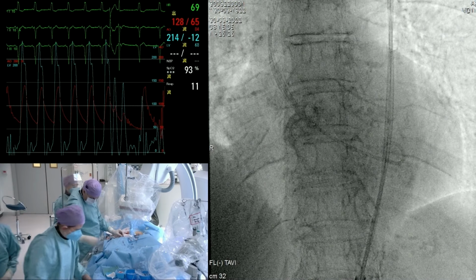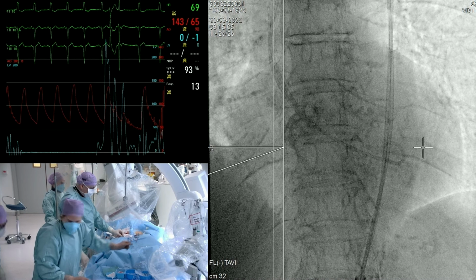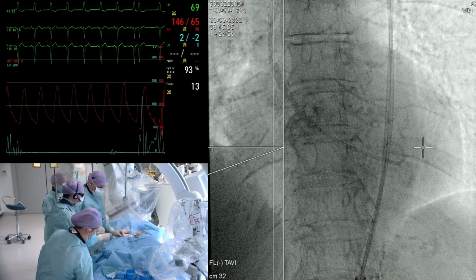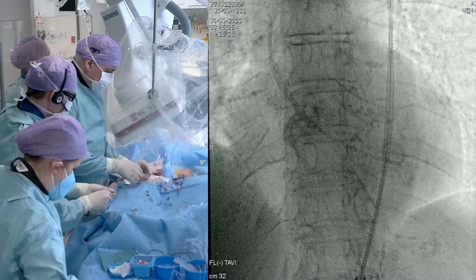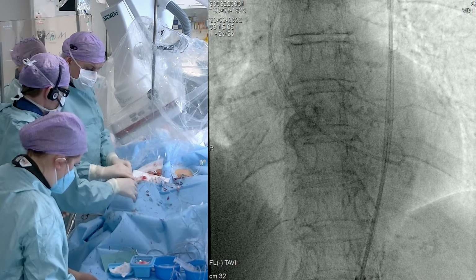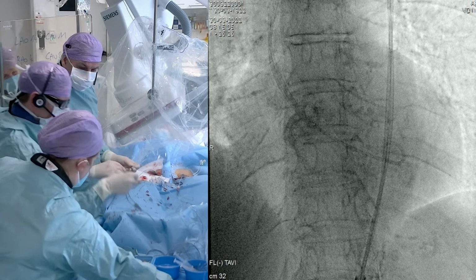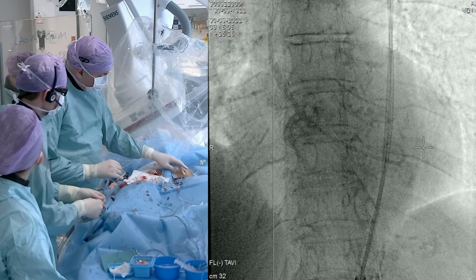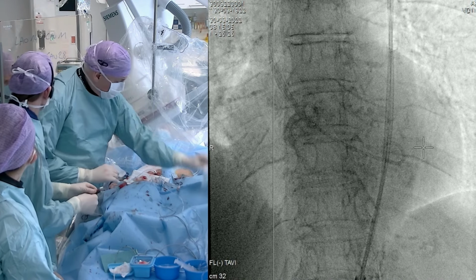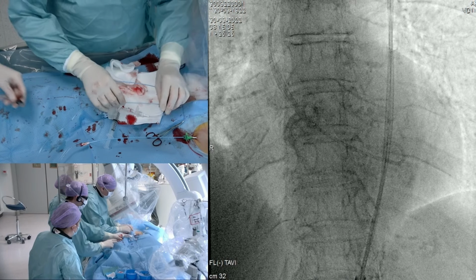Yeah, all right. So we can come with the stiff wire. Let's also maybe get the pacing. That's maybe also interesting to get in place and show. So that's something maybe you can explain, what you do here. Yeah, as I think most sites have moved to use LV pacing instead of RV pacing, having one electrode on the stiff guide wire and having a needle in the skin for the second one, it often causes muscular contraction. It's a little bit unpleasant for the patients.